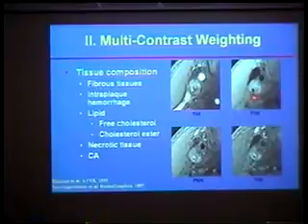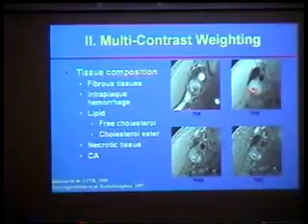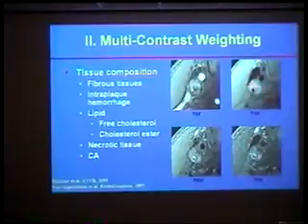In this case, blood flow is suppressed. So what you see here is dark lumens in the internal carotid, also dark lumens in the external carotid. Also, you see there are different signal features indicating different tissue groups in the wall. These are similarly taken with proton density weighted and T2 weighted, and the flow is suppressed in either one of these. But you also notice that different tissues appear very differently, such that if you look at a lumen, surrounding the lumen there's a bright band on T2, and it is not apparent on any other images.